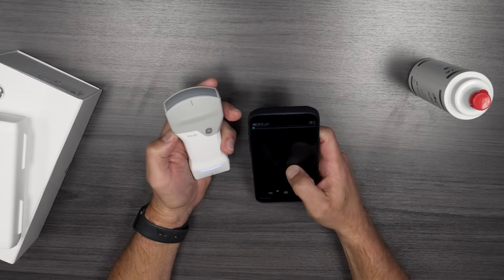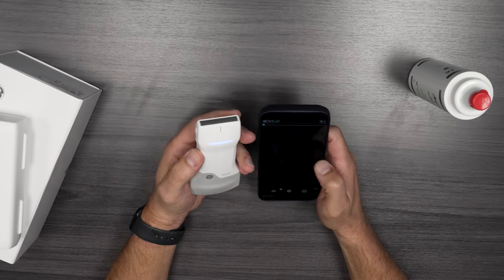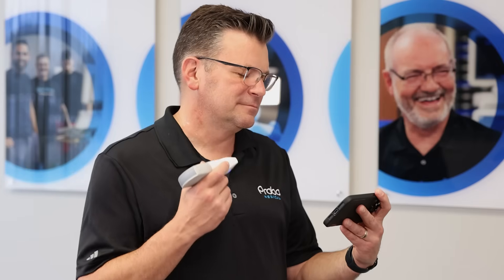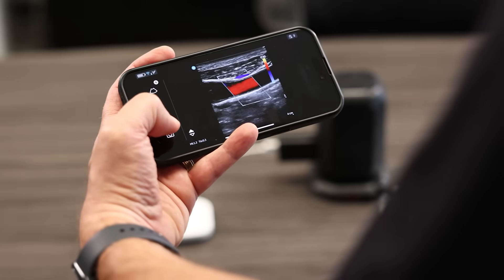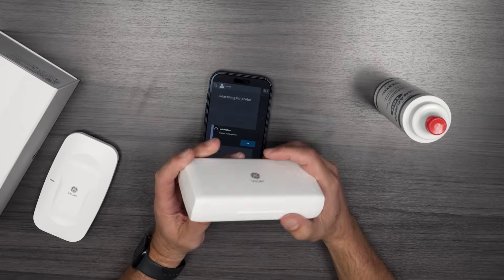Now with the linear set up, you can scroll up and down to change the depth. I'll go ahead and do a quick carotid right now to show you what that looks like. You have all the color Doppler and other modes available, but it's really great just for one-handed operation. Pretty impressive little machine.